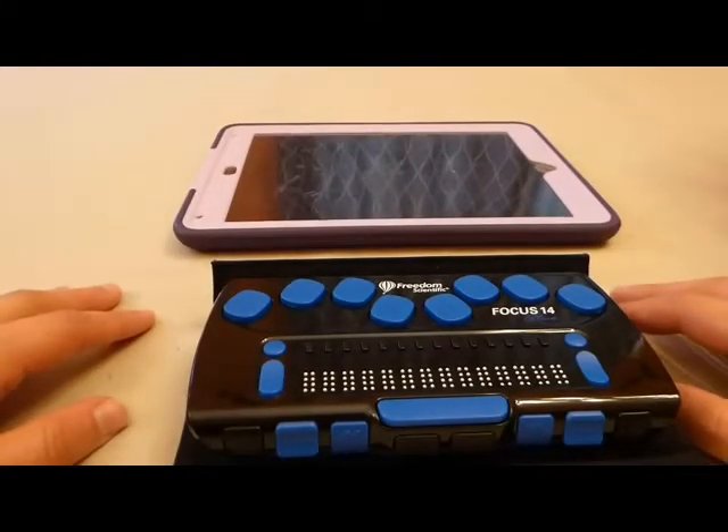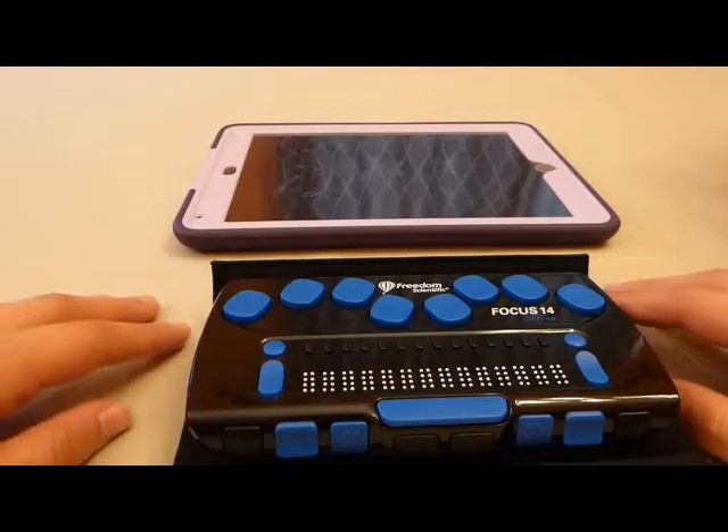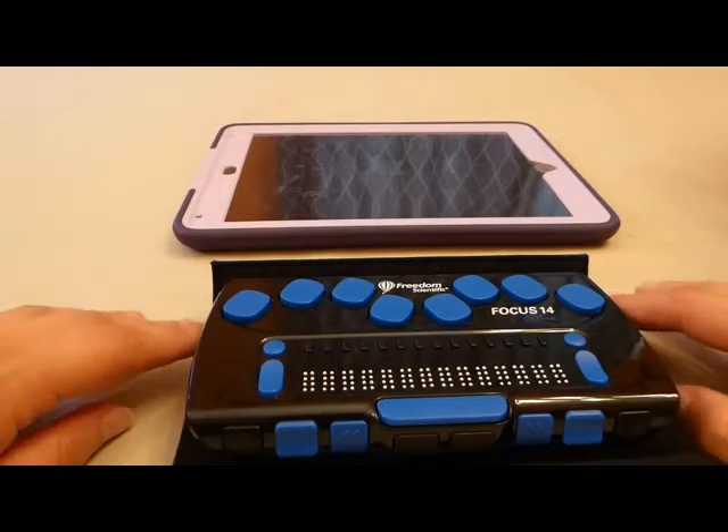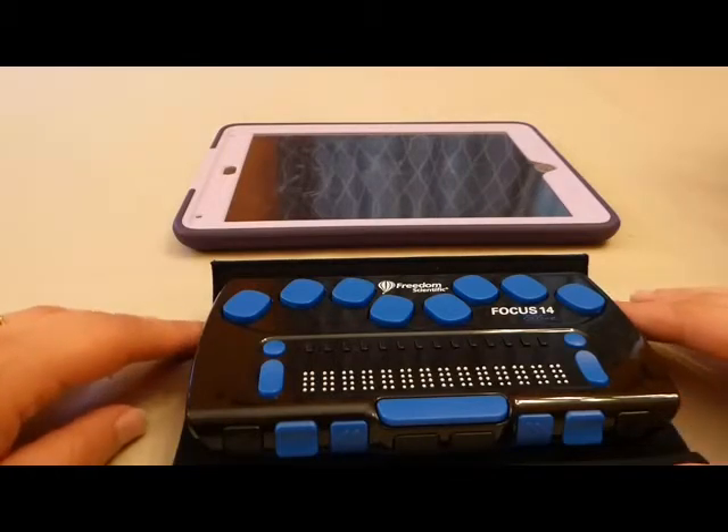Hi, my name is Laura Jones, and today I'd like to demonstrate some of the concepts that I explain in my article on Perkins Paths to Technology, called iOS Devices and Focus Braille Displays.